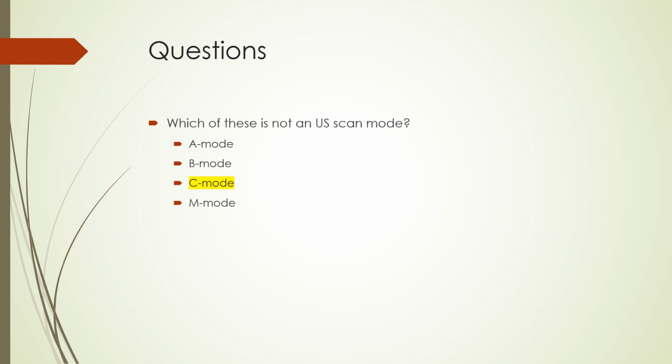If you chose C mode, you'll be correct. The A mode is our amplitude mode, B mode is brightness mode, and M mode is motion mode. So we discussed this a few slides back. The correct choice here is C mode. This is not an ultrasound scan mode.